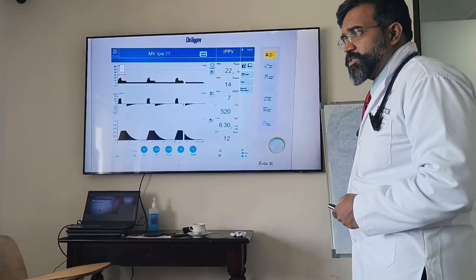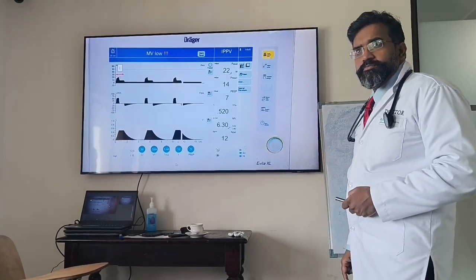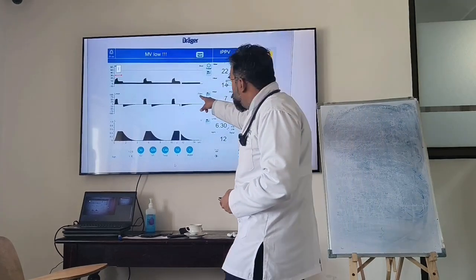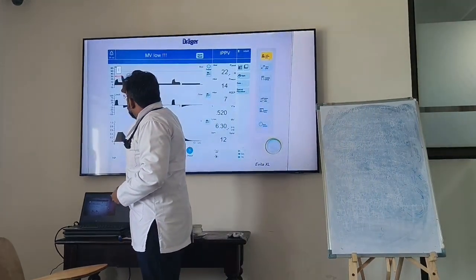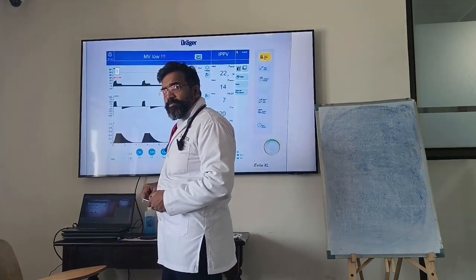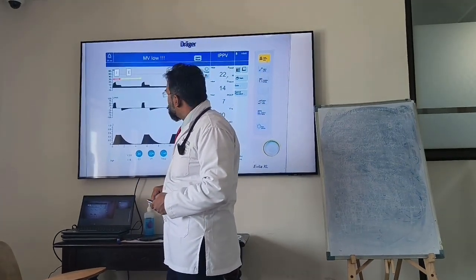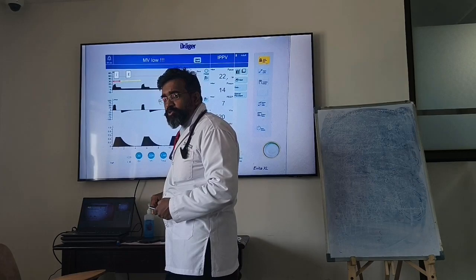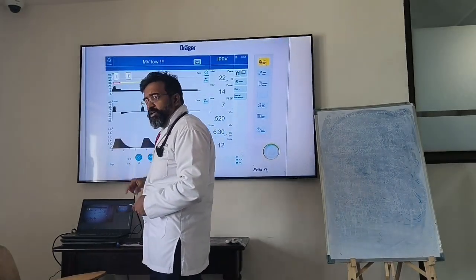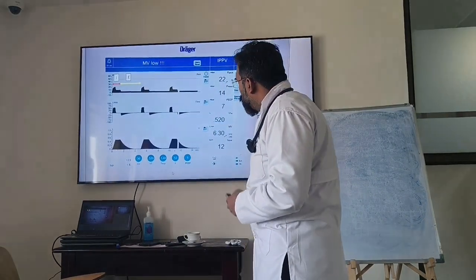That is your inspiration. Understand carefully. The inspiration is going on till here. This is your expiration. So it's almost 1:2, isn't it? It is 1:2. If it is 6 seconds, then this is 2 seconds and this is 4 seconds. Inspiration, expiration.